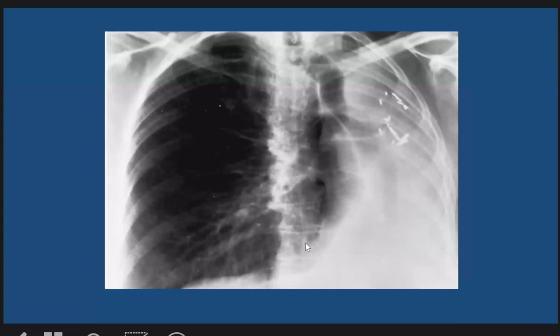Here is a patient with pneumonectomy. We see total opacification of the left hemithorax with multiple surgical clips on the ribs. The trachea is shifted to the left side with compensatory hyperinflation of the right lung.